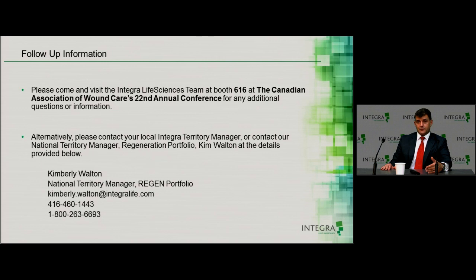Now, sometimes we're worried about using certain therapies because the wound is quote-unquote too deep. In the ideal situation, and we have limitations on what we can do outpatient, inpatient in the U.S., IDRT therapy really doesn't have a too deep in it. So that's not a limitation. I also think that anything with an exposed tendon, a sliding structure, ligaments or joint capsule exposed, IDRT therapy is an immediate choice because you're going to protect that wound very quickly and decrease moisture imbalances that might make that joint or that tendon never work again.